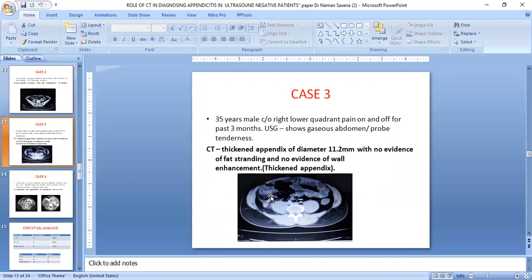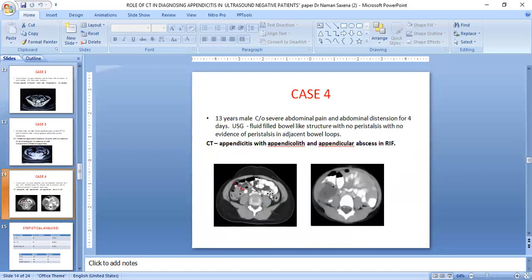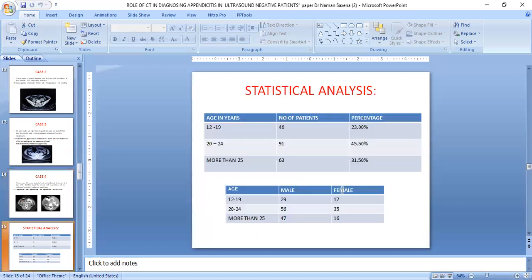On CT, Case 3 showed an appendix diameter of 11.2 mm with no fat stranding and no evidence of perforation. Case 4: A 13-year-old female presented with severe abdominal pain and abdominal distension for the last four days. Ultrasound showed a fluid-filled bubble-like structure with no definitive findings. However, CT showed appendicitis with an appendicular mass — a rounded lesion consistent with an appendicular abscess.